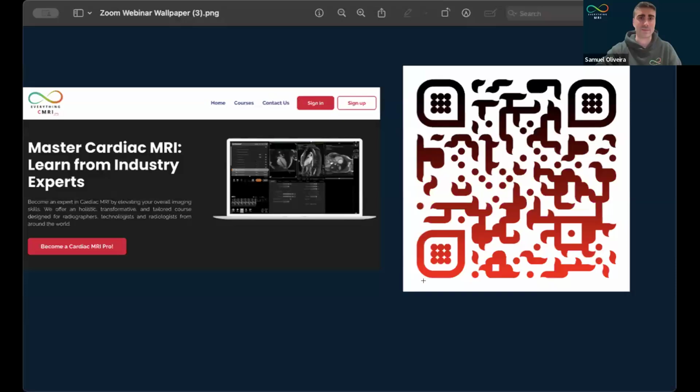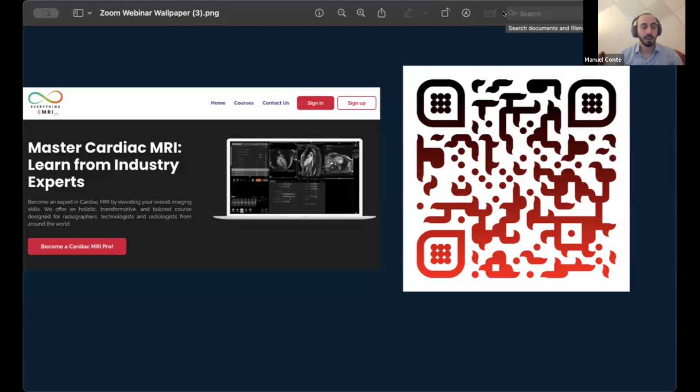That's fine. Okay. As I said, Daniele, in my presentation, turbo spin echo and spin echo are better than gradient echo. When we scan a cardiac examination, normally in the cine, we use the true FISP, so the steady state free precession. But in case we have patients with a cardiac pacemaker that is MRI conditional, and it's okay, and we get the artifact, I suggest to use the FLASH.